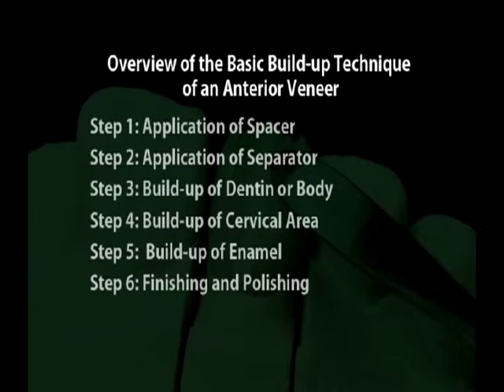Overview of the basic build-up technique of an anterior veneer. Step 1: application of spacer. Step 2: application of separator. Step 3: build-up of dentin or body. Step 4: build-up of cervical area. Step 5: build-up of enamel. Step 6: finishing and polishing.